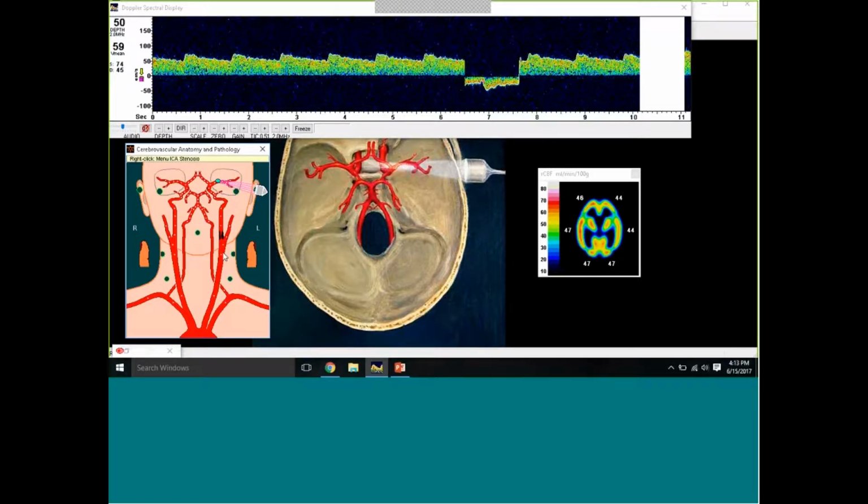the surgeon's going to occlude off this vessel to clean it out. So they're going to occlude off this common and the internal and the external. So they're clamping off all three of these vessels. So they're going to shut flow off, and they want to see what the collateral flow patterns are. So if we clamp that off, you see we're pretty good. Nothing really happened.